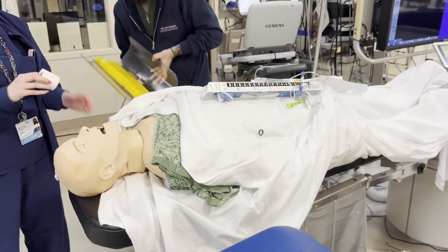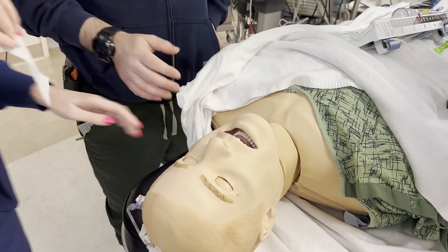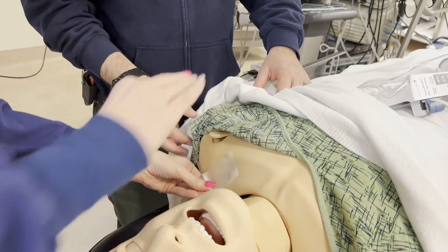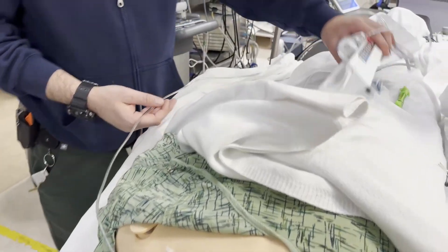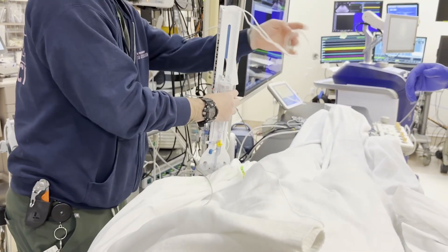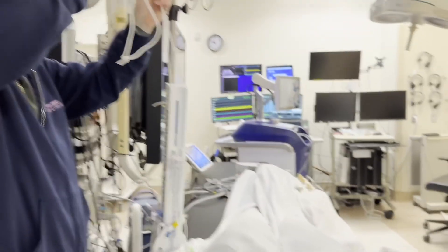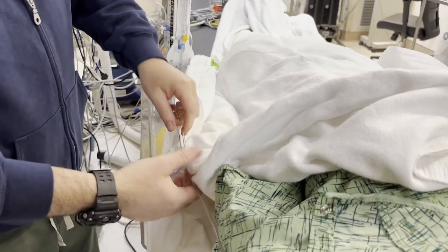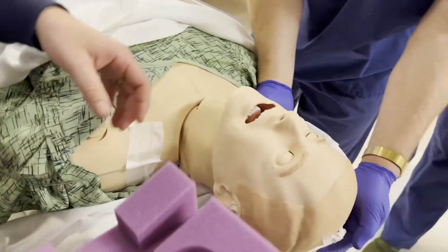We're going to get the arm board and talk about safe measures of keeping this attached so there's no chance of it coming out. She's going to tape the drain to the patient's shoulder so it won't get pulled out. We're also going to make sure the drain gets hooked up safely, and for extra measures, use this cable and hook it around one of these hooks. We can also tape this to the arm board for extra safety.